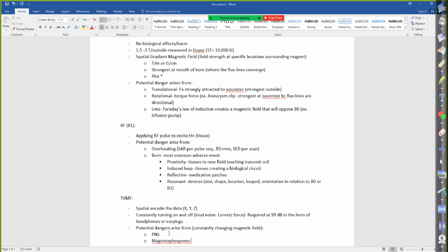If you cause any kind of malfunction of the normal contraction and relaxation of the heart, it could definitely cause the heart to go out of rhythm. That's where it would be really of concern, where it's not just peripheral but really dealing with a major organ.